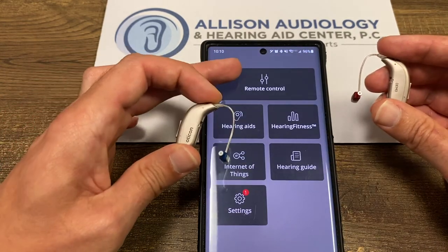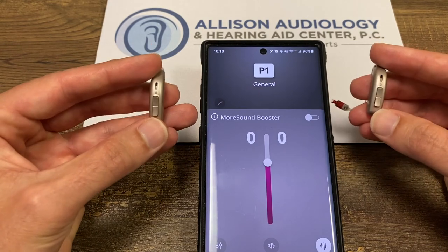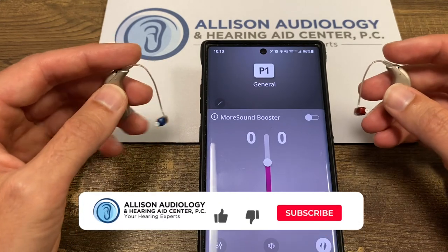You would use the remote control to access volume control, or you have the option of changing the volume if it's activated on the physical buttons. Thank you for your time.